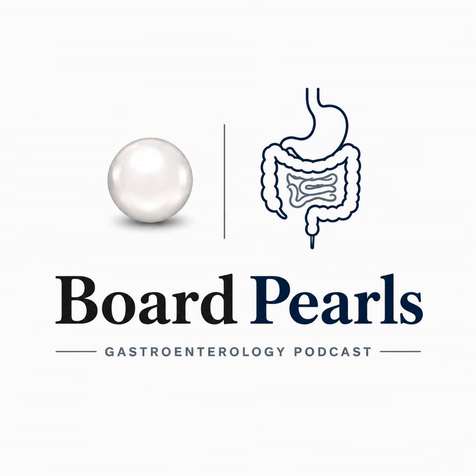Step back and the whole episode runs on one habit of mind. EUS lets you reason from substrate to answer. The layer and echotexture place the lesion and narrow the differential, so you bring the right needle. The diagnostic question, cells or architecture, picks aspiration versus biopsy. The fluid chemistry reads the epithelium that made the cyst. And when the target is pain rather than tissue, the same anatomy the needle reaches becomes the thing you treat. The agent is matched to whether the disease is malignant or benign, and the complications read directly off the sympathetic outflow you just interrupted. Match the tool to the substrate, and the answer follows.